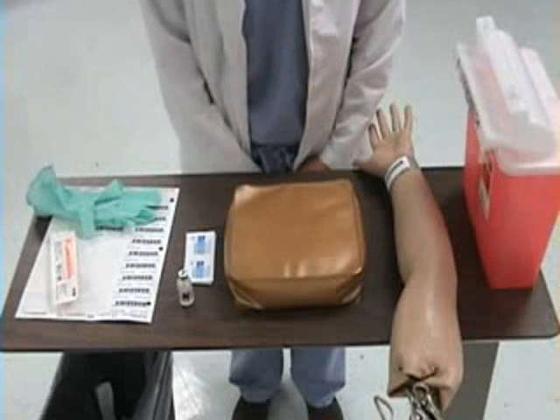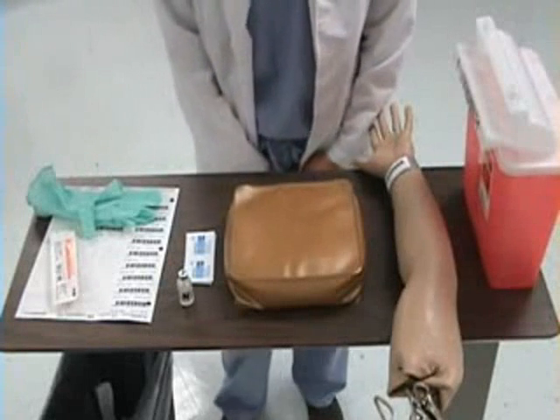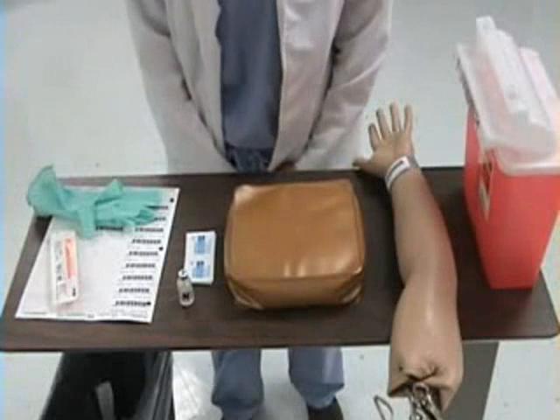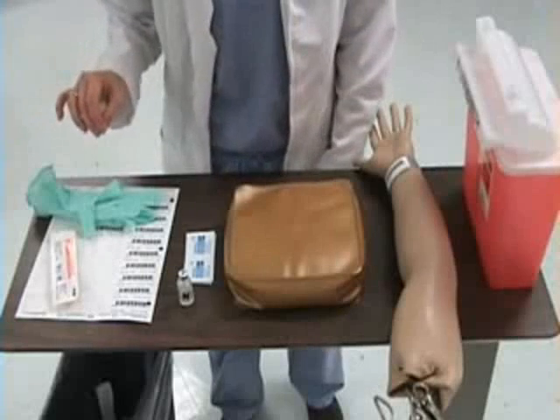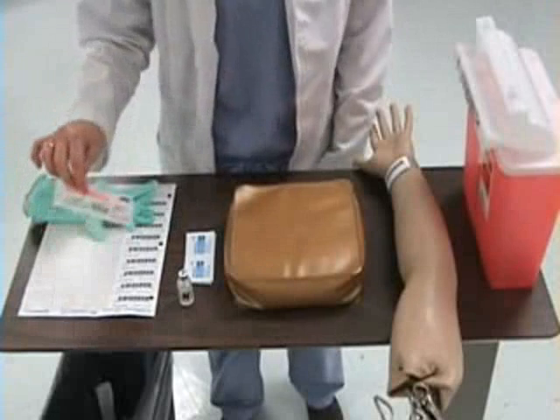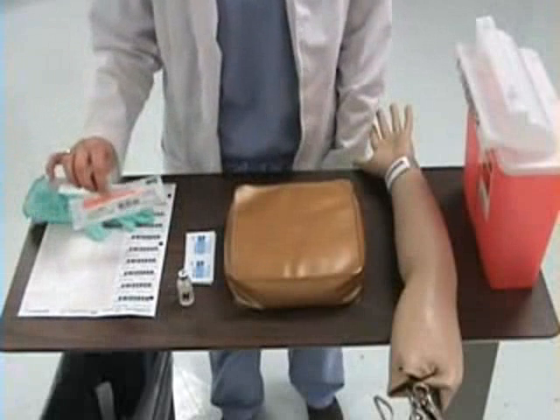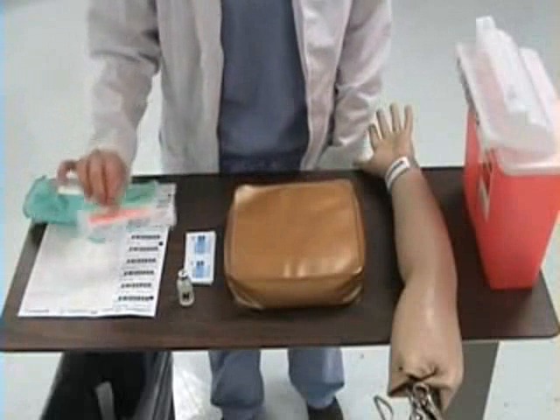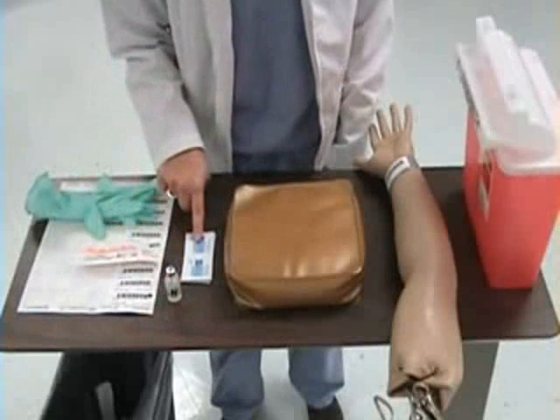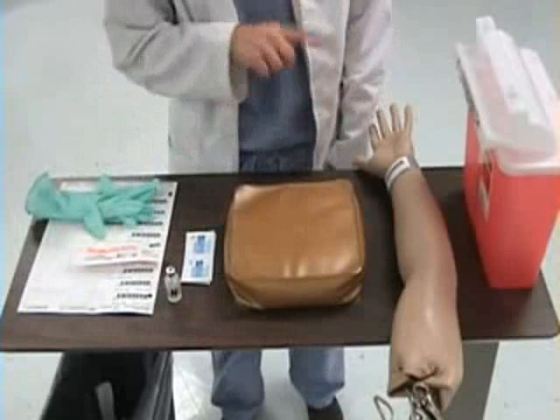This is how to administer a subcutaneous injection. I will begin by checking my PCP orders and gathering my supplies. To administer this injection, I need gloves, patient labels. Today I will be administering insulin, so I will need an insulin syringe. I will need my vial of insulin, alcohol preps, a trash container, and a sharps container.